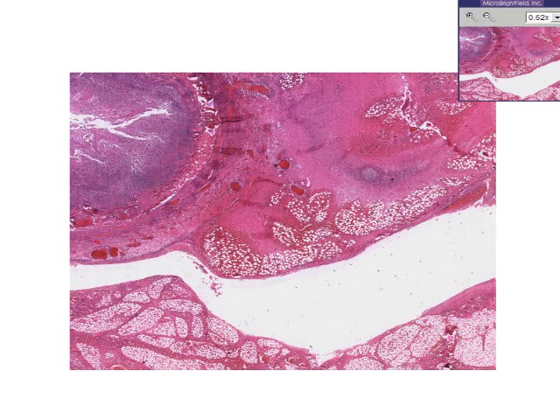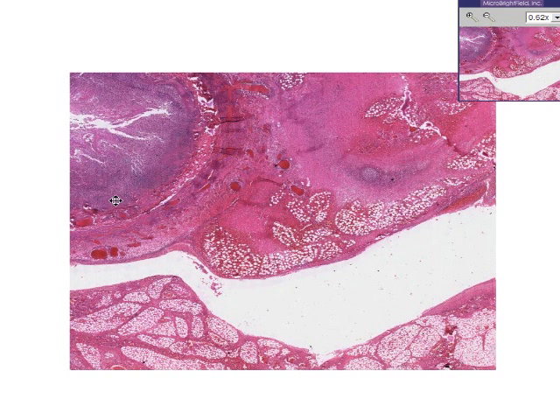The next slide is entitled peri-appendiceal abscess. Similar to the last appendix we saw, you can make out the fact that here is the lumen and there's a lot of lymphoid tissue in the mucosa and submucosa.